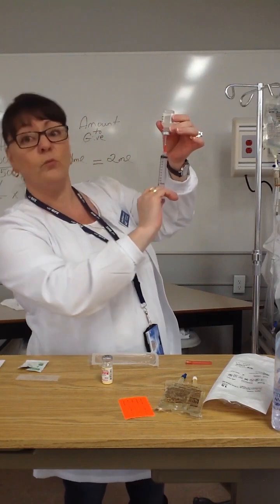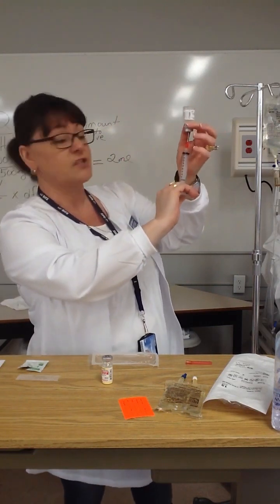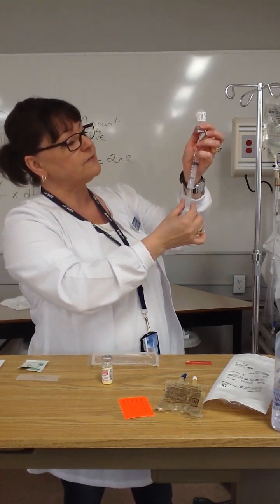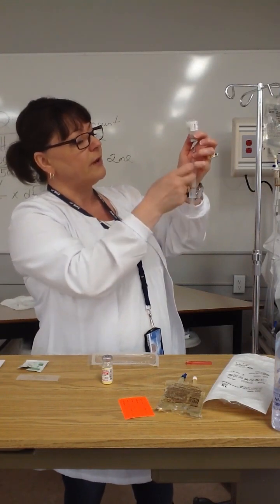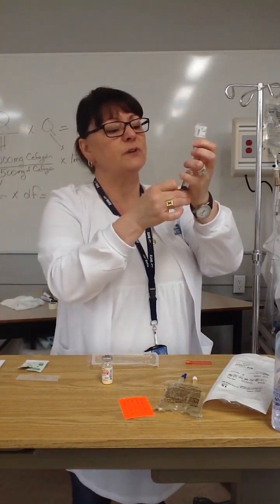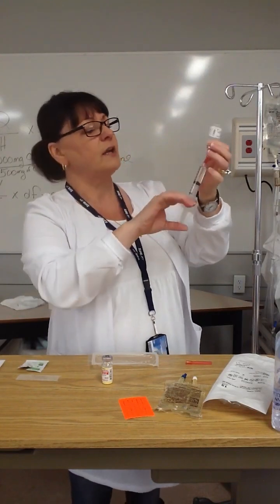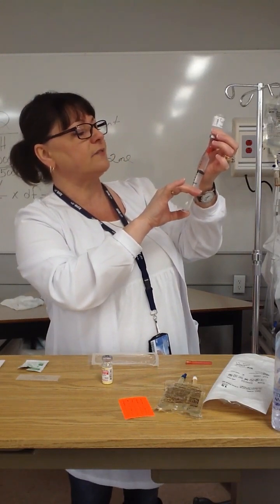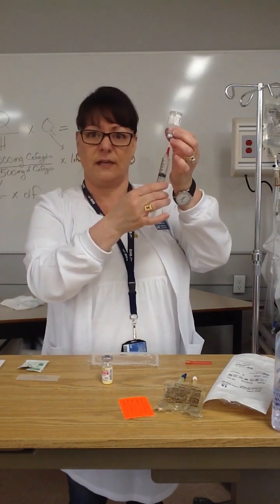You can see the little window. You can see I have my needle well submerged in that fluid. I'm going to stabilize that syringe against my palm, and I'm going to allow 5.5 mils of fluid to fill in there. You can go a little bit past it if you want to. That's why you need to stabilize it and hold on tight to every part of your setup so that you can wrap that syringe, get the air out, push it back in if you need to, and finish with exactly 5.5. Must be accurate, okay?